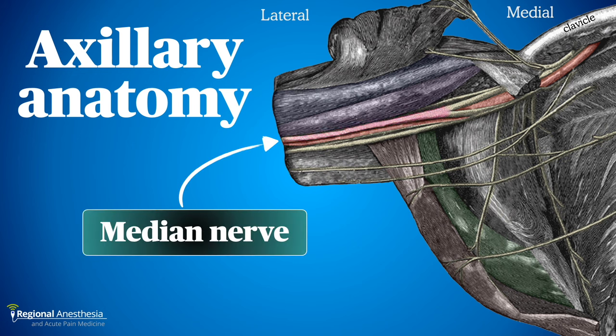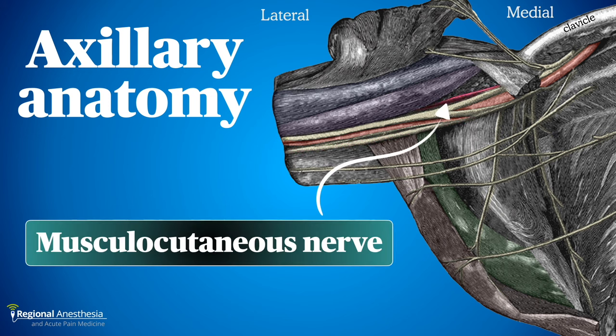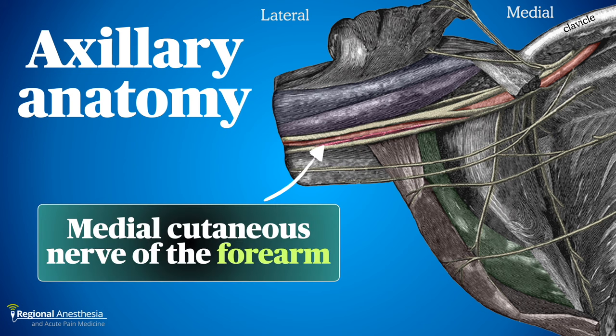At this location we can see the individual nerve branches. The median nerve is superficial and on the same side as the coracobrachialis. The ulnar nerve is also superficial but on the other side of the artery. The musculocutaneous nerve usually takes off early from the lateral cord and travels through the coracobrachialis muscle before emerging between the biceps and coracobrachialis.